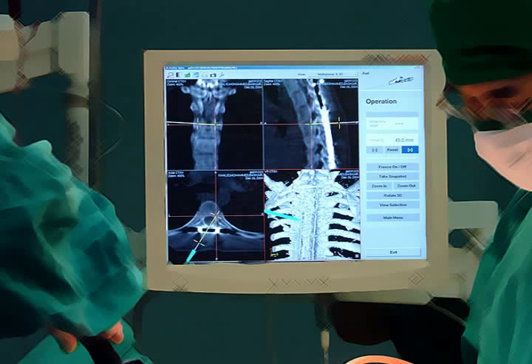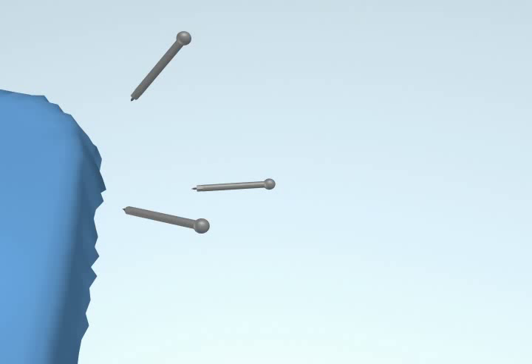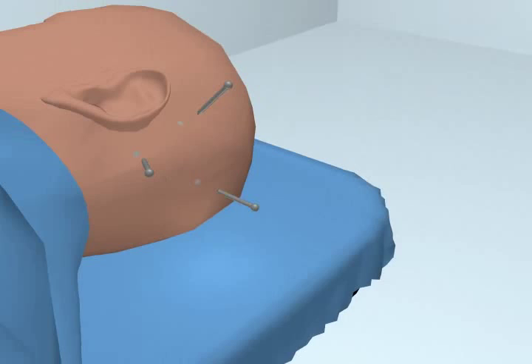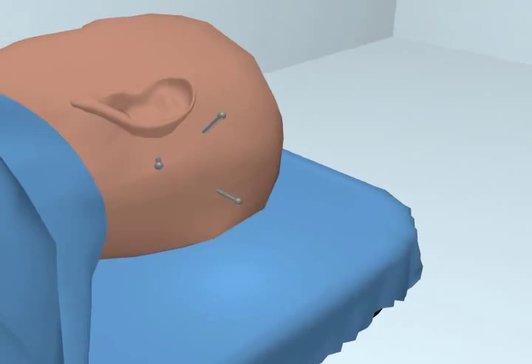To do that, we must attach fiducial markers to the patient's body before acquiring CT images. These markers can be localized both on the CT scan and the patient.